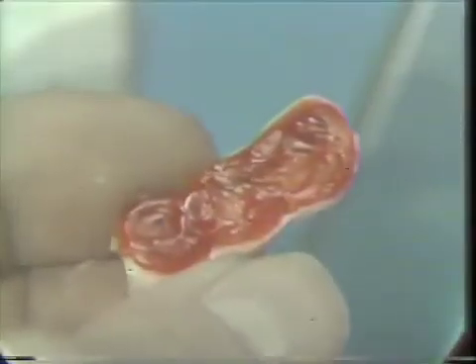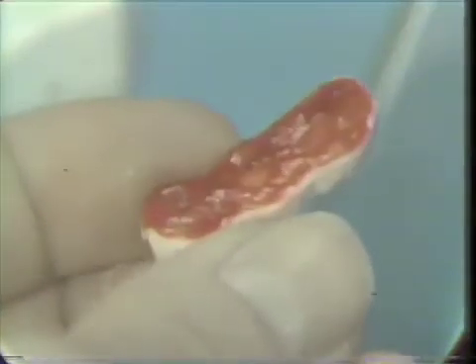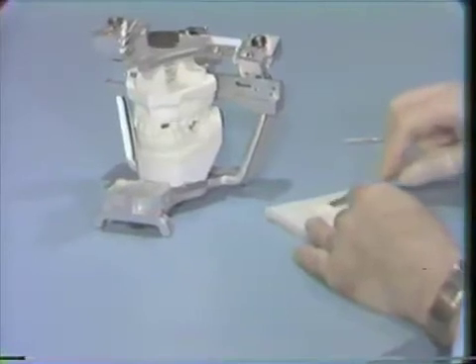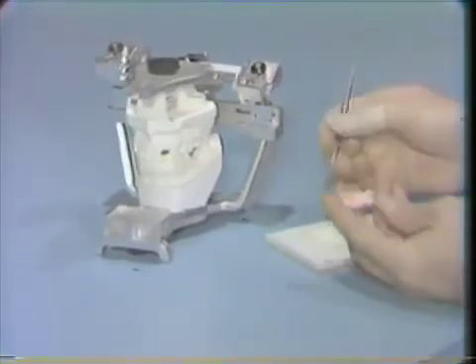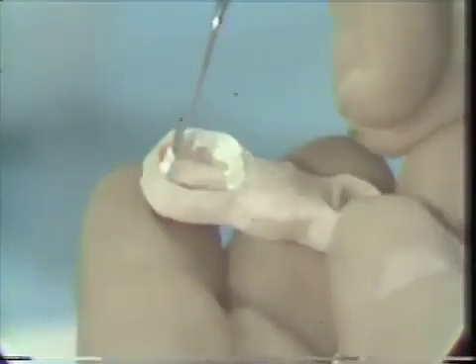We've now applied a sufficient amount of wax to the platform, and with the direct technique which we are now describing, we will cement the platform directly into place in the mouth, and we can use one of the temporary bridge cements, and here we're going to use some Temp Bond, and we'll just add a sufficient amount around the peripheral edge of the teeth to stabilize the platform in the mouth and in place. The reason for doing this is to be sure that we have an absolutely stable platform and that we have a registration which is as accurate as we can possibly make it.